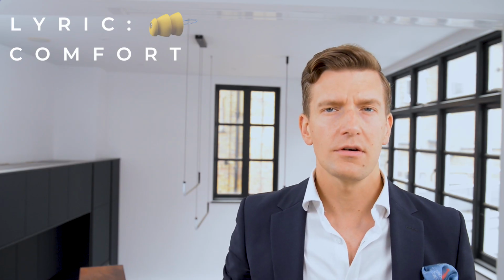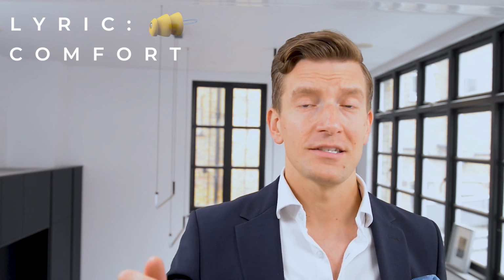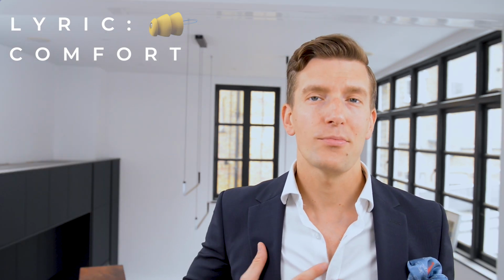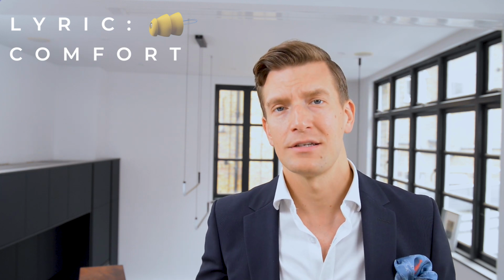You might be asking yourself, why have they made it bright yellow if it's designed to be the most discreet hearing aid that's out there? And it would be a good question to ask. The reason being is that if we pull a Lyric out of somebody's ear and something's left behind, it's really easy for us to see. Now saying that, in my practice, I've been fitting Lyric for 7 years and there's not been one occasion when anything's been left behind in somebody's ears. So it's not really anything you'd need to worry about.